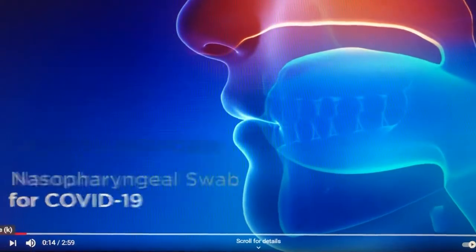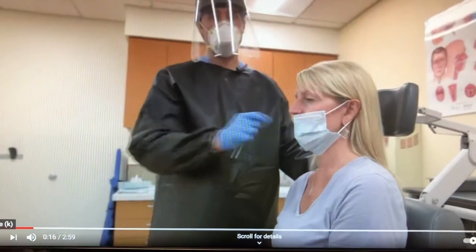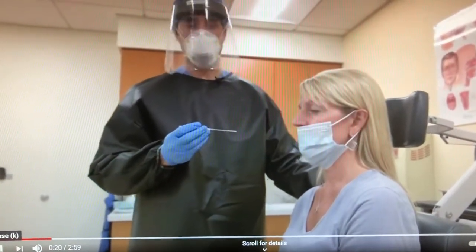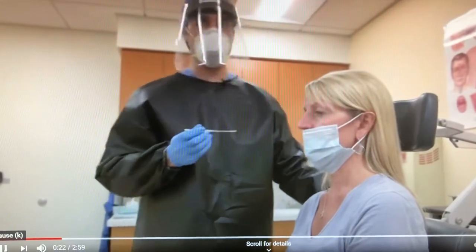Prior to performing the nasopharyngeal swab, ensure that the patient's mask is still on and covering their mouth, as this will protect you from any inadvertent coughing or sneezing during the procedure.